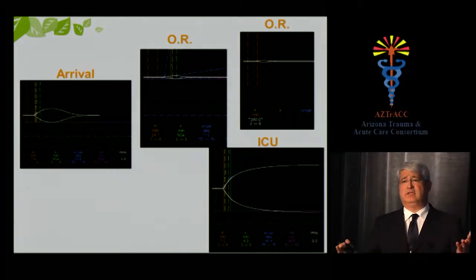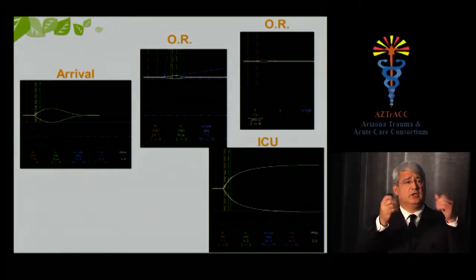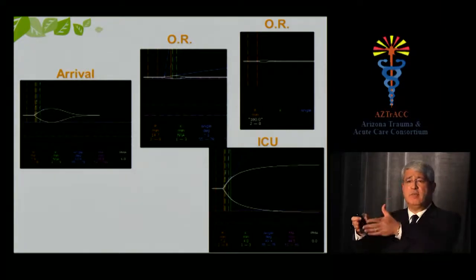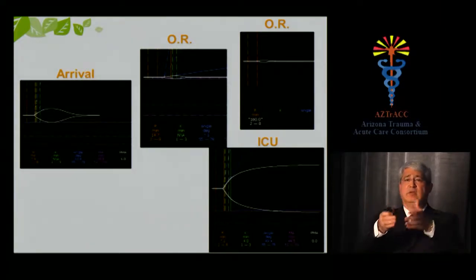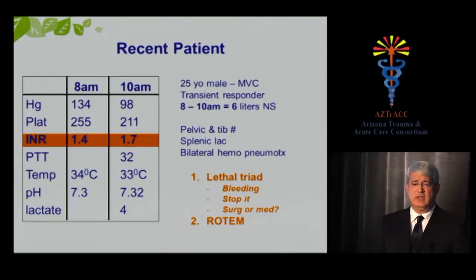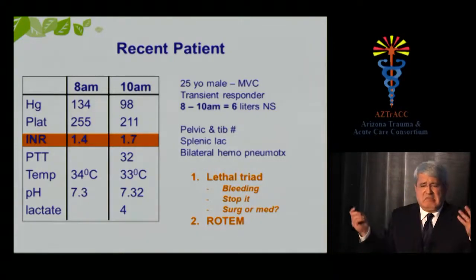And that's the beauty of this test. It tells you the problem is coagulopathy, and whether the problem is coagulopathy because the clot is too weak, or because they're hyperfibrinolytic, or because there's something else wrong with this patient. And this is a recent patient that we had, and I'm not going to go into the details.